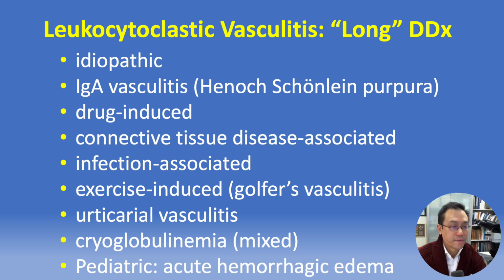So the long differential diagnosis for LCV is too long to fit on one slide. My experience actually is that clinicians don't really need it. So rather than cluttering up the pathology report with a long list, usually a diagnosis of LCV suffices. And then if the clinician has a specific question to address, that can be addressed. But just the long boilerplate is usually not needed.